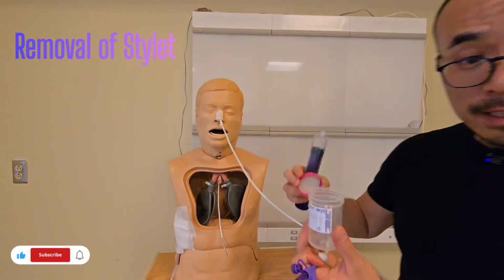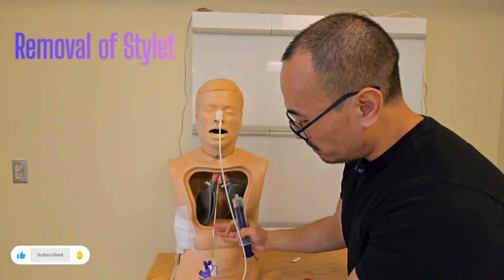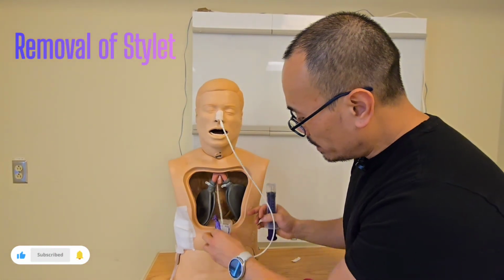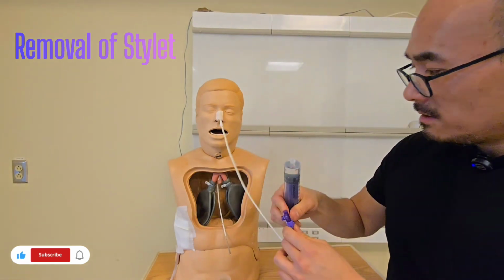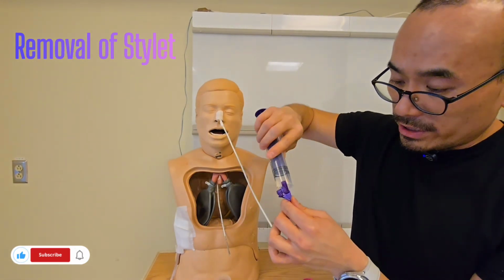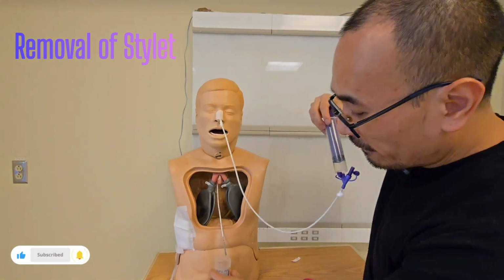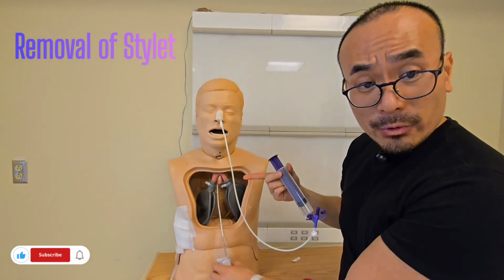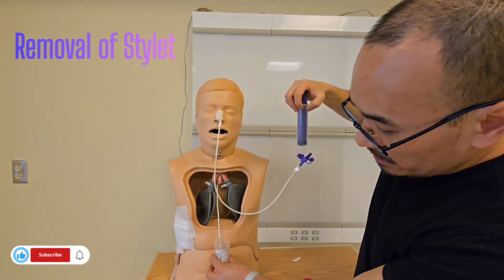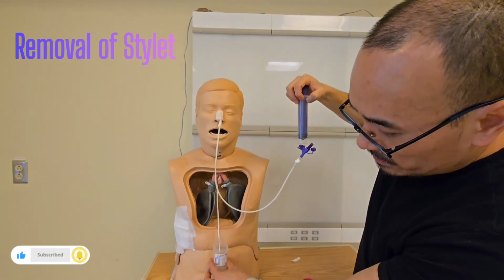I am going to use a little cup over here so that it doesn't drip all over, okay? But I want to show you how it actually looks. So the second part is going to be to remove the guide wire. We're going to twist our syringe on, and we're just going to flush it one more time. Remember, this is already inside the patient, so you won't see any of this. But as we start to irrigate the tube again, you start to see.